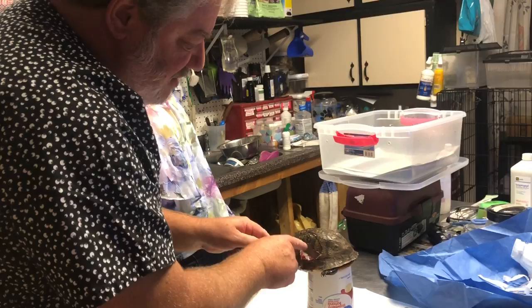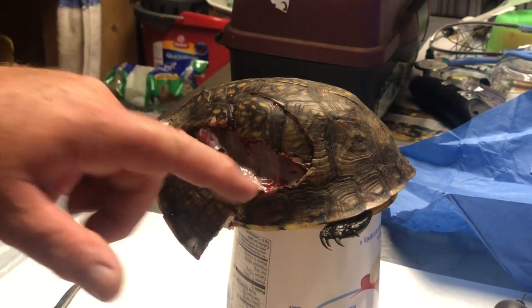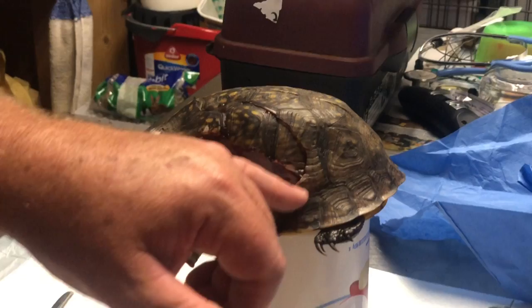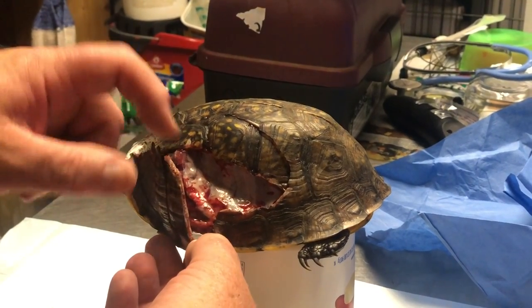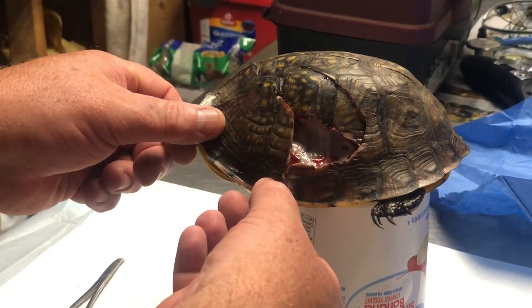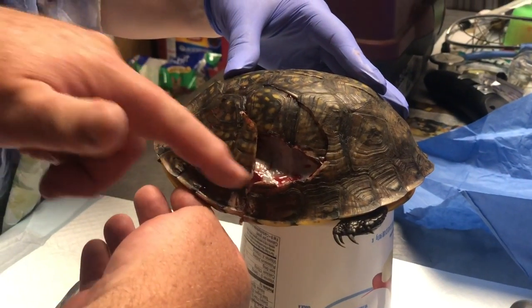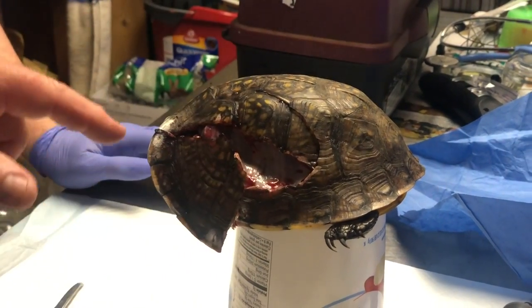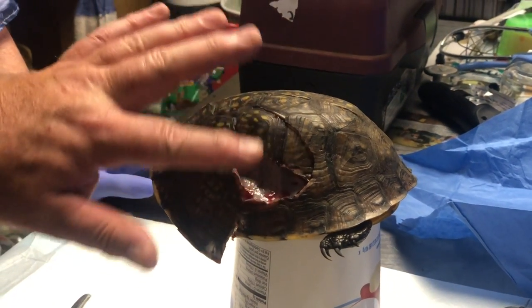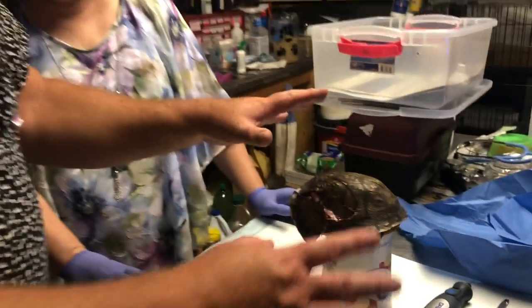Where this piece of membrane right here is — that's the periosteum that lines the inside of the shell. Every bone in this turtle, every bone in every animal, is covered with periosteum. The good news is all this shell right here is probably going to die, and part of this shell here as well, because you can see where it's removed from the periosteum. But we're going to put this shell back as a kind of physiological bandage. Over the next few weeks we'll give it a chance to heal, then come back with a different Dremel bit, put him under anesthesia once he's stable, and grind away the dead bone. The fibrous tissue there is going to actually start to fibrosis in and become cartilaginous over time.